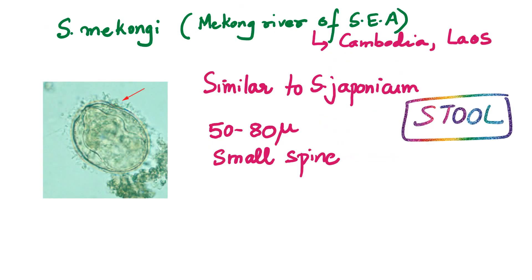Schistosoma mekongi is only reported along the Mekong River in Southeast Asia, mainly from Cambodia and Laos. The eggs are found in stool and are very similar to japonicum — rounded or oval or subspherical, 50 to 80 microns in size — with a small spine. Mekongi and japonicum look almost the same.